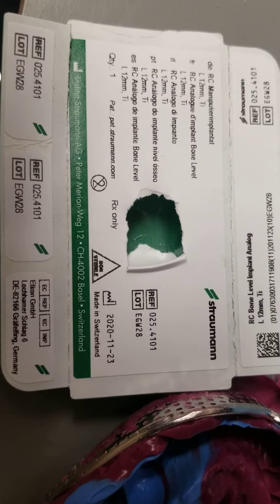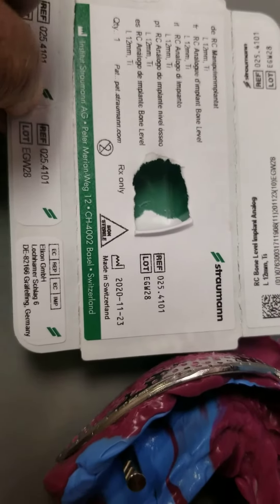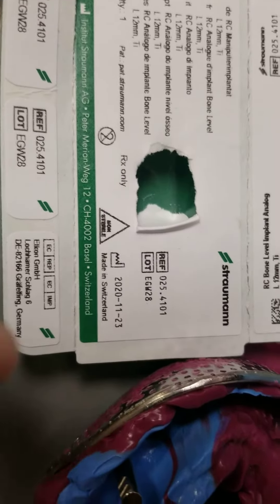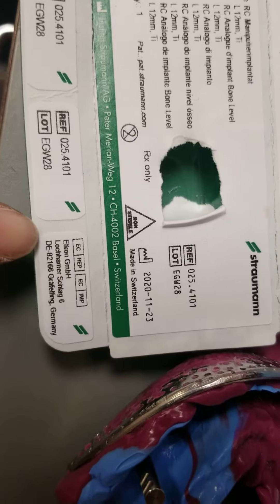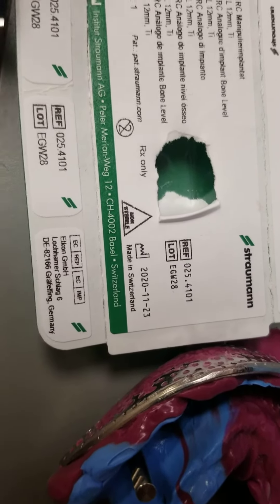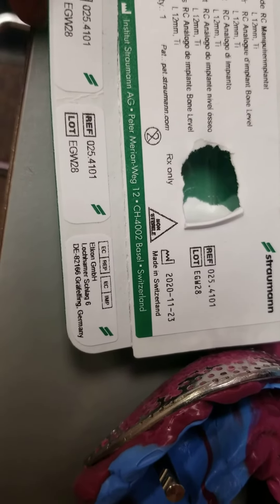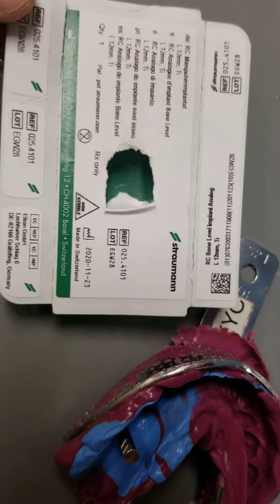The first date on it is 11-23-2020, made in Switzerland, that's when it was made. And then it'll show you that it's a GmbH, which is a German company. So that is basically all there is to it.